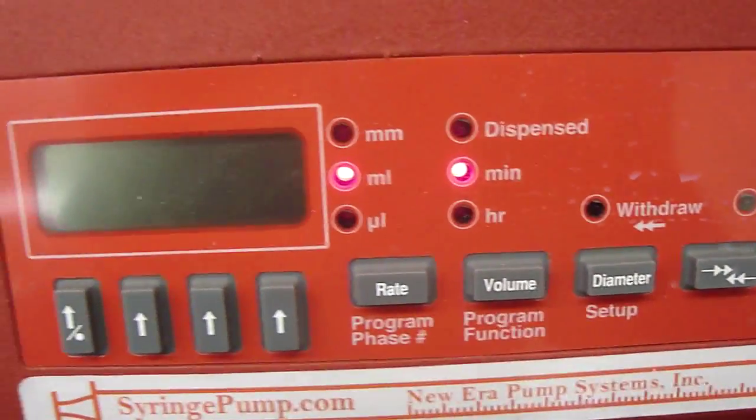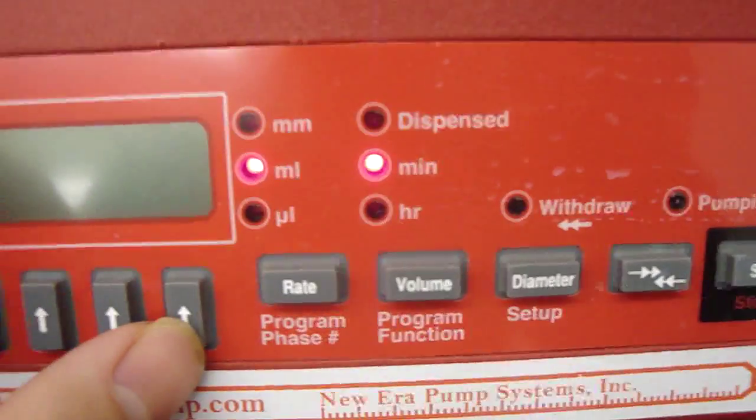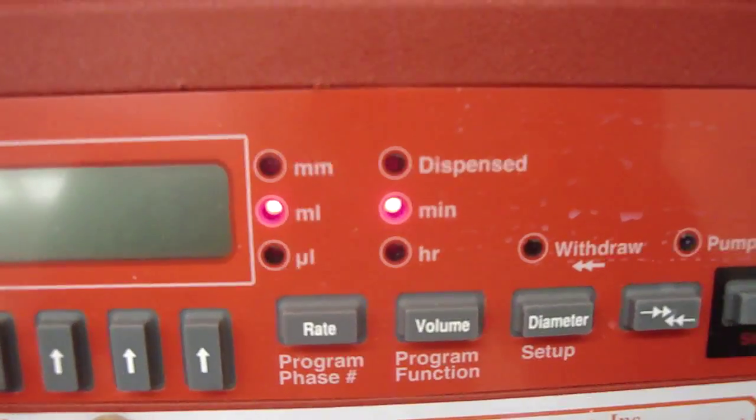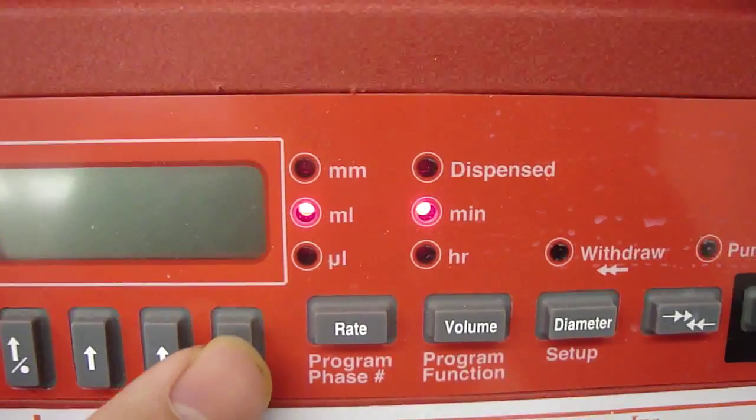So the first thing you can do is to change the rate. For example, you can change from 12 to 17. Just press the arrow below the number.